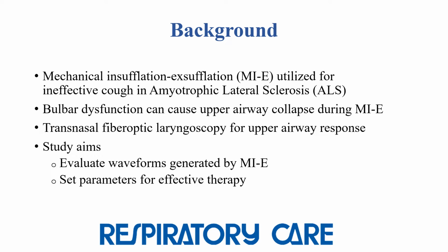Cough augmentation with mechanical insufflation-exsufflation has become standard therapy for treating ineffective cough effort in ALS, but upper airway collapse during therapy as a result of bulbar dysfunction can decrease the effectiveness of MIE. And this can occur during both insufflation and exsufflation, and increasing the pressure can lead to a greater degree of obstruction. Transnasal fiber optic laryngoscopy has been used to evaluate upper airway response during therapy and has been successful in some cases for optimizing settings to eliminate laryngeal collapse. But it is an invasive procedure and it may not be readily available.